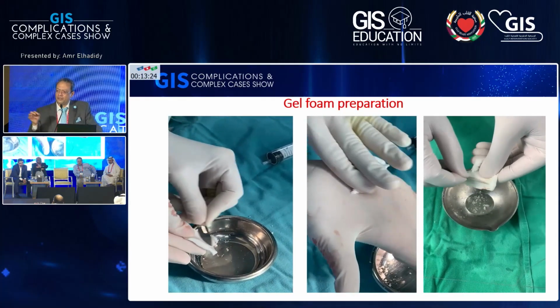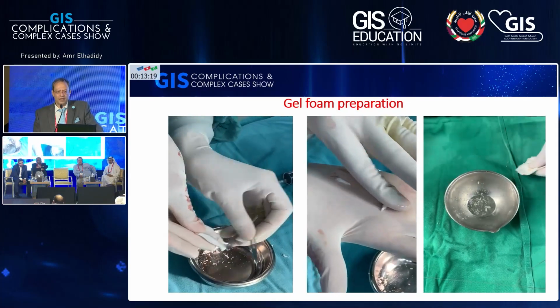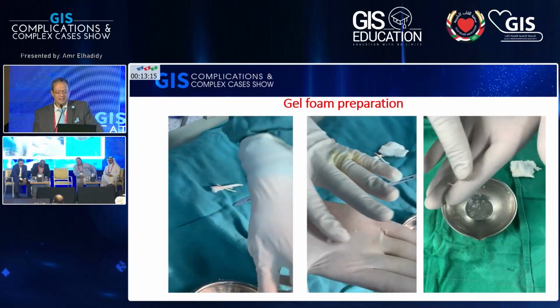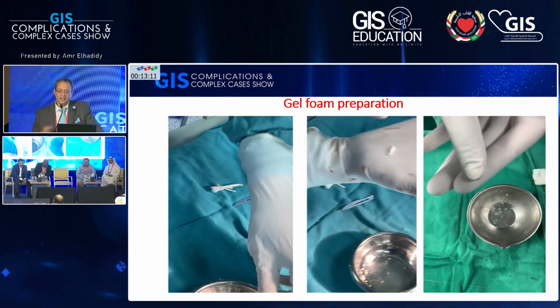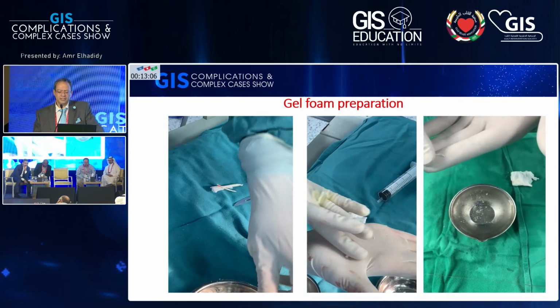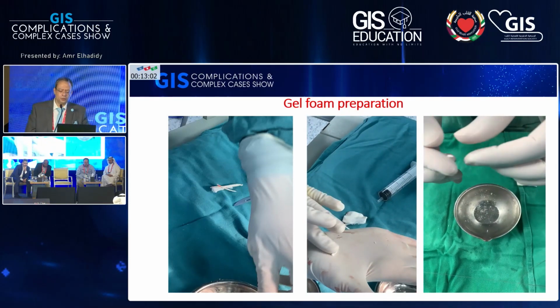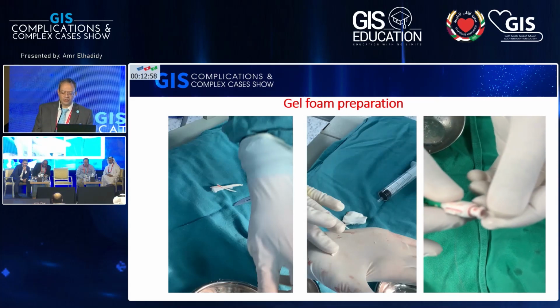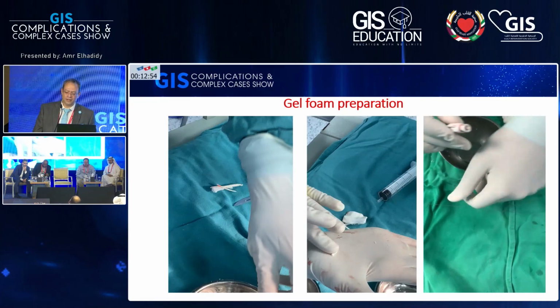As you see, I put it inside the microcatheter, and then pushing by the back of the wire a little, and pushing inside the microcatheter. And then after doing this, you can inject with saline inside the microcatheter with a small syringe, and try to push all these particles into these collaterals. And this is a very important point, that you need to have very, very small particles, because you cannot push it easily inside the microcatheter and then push it with the wire.